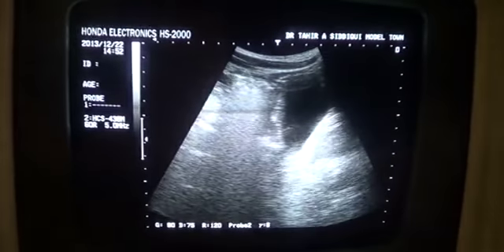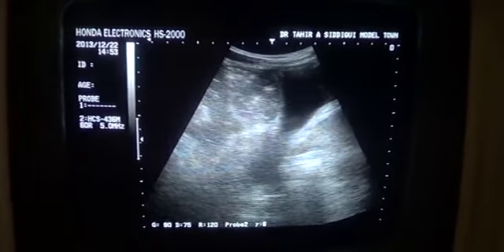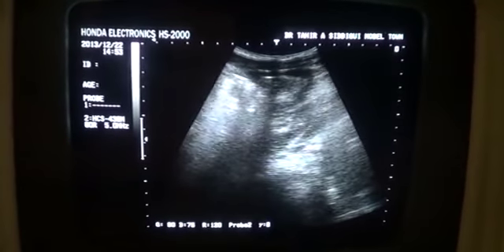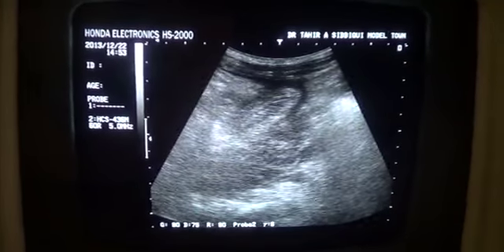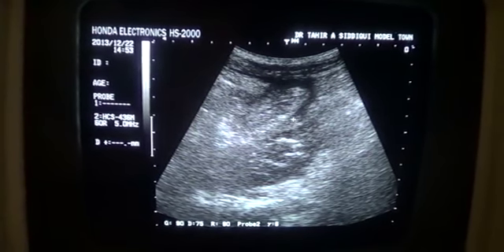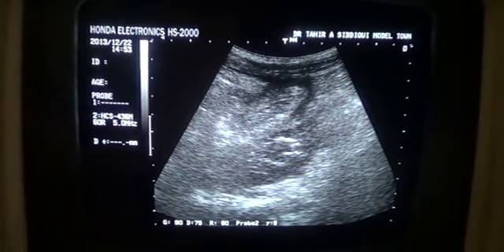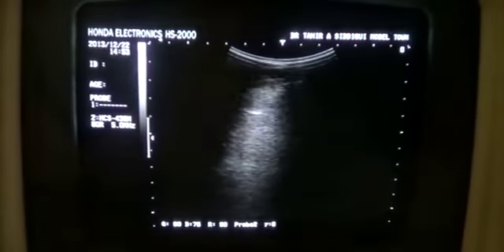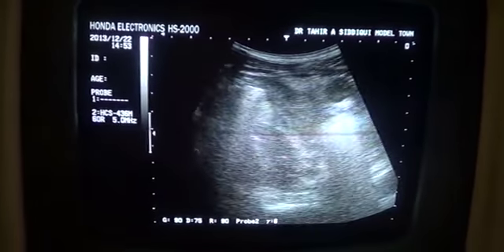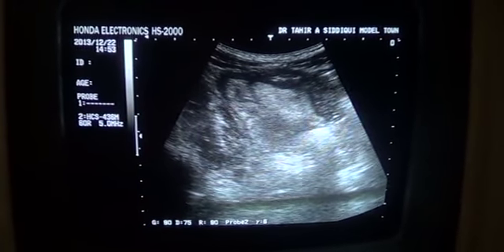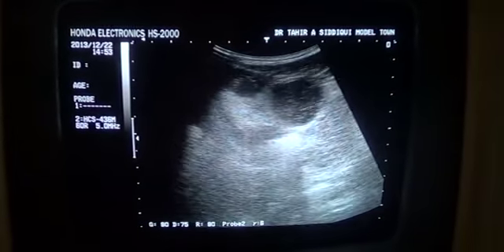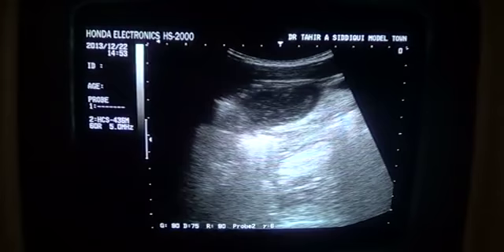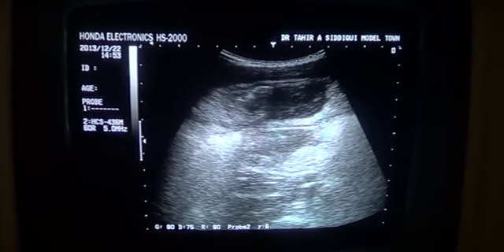This is the urinary bladder again in longitudinal section. Now this is a trapped bowel segment — a bowel segment trapped and surrounded by fluid. So this is an abscess pocket within the bowel segments.